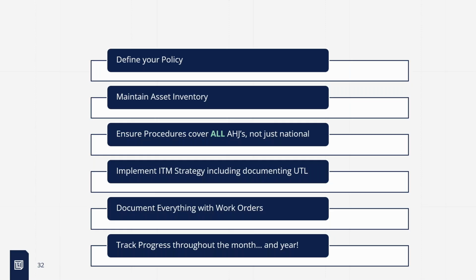So if you have reports, make sure you have a rolling report or static documentation, either printed or a PDF made at the time that you write the report. If you're running dynamic reports, make sure that data is not getting inadvertently reactivated. We've had customers inadvertently reactivate a year's worth, or assign them and activate them. They forget to put a date range on a search, and all of a sudden update 2,000 work orders to be something.